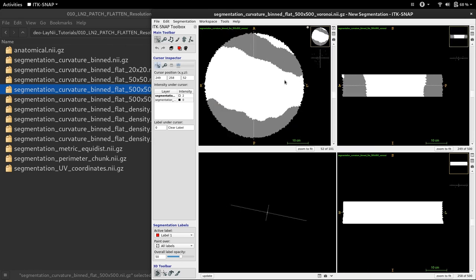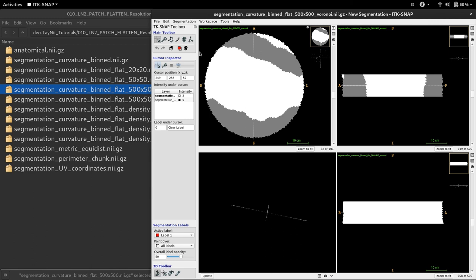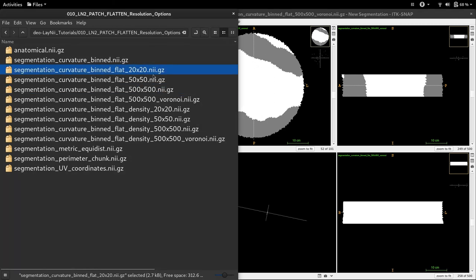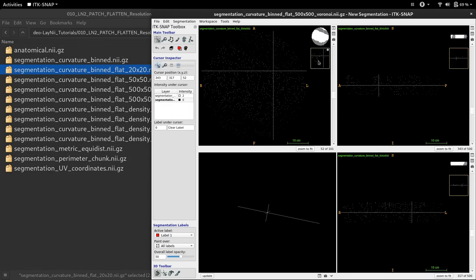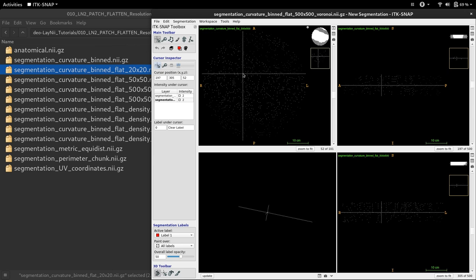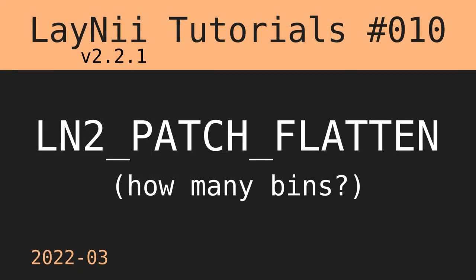Just to summarize, today I've showed you the decisions of the final flat cortical chunk that we want to have in terms of being dense or sparse, when we think about the folded brain voxels falling into the bins in our flat representation. I don't think there's a best approach here. It depends on what you're trying to do. You might choose dense resampling or dense transformation, as I showed before with the 20 by 20 example, or a sparse flattening which puts many more voxels than you have available in the folded brain voxels into the flat domain, and then you solve the empty voxels problem by interpolating in between just for visualization. Hope this was informative. Thanks for listening.